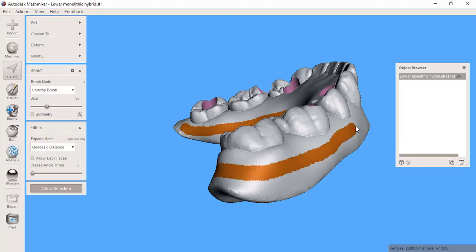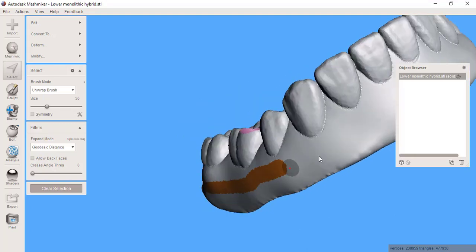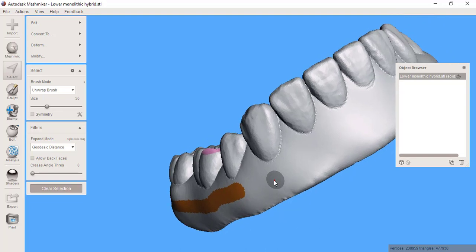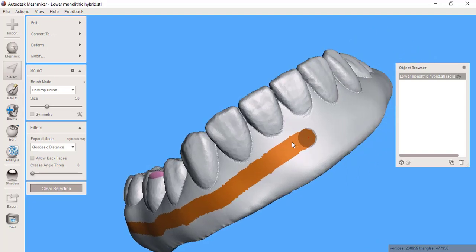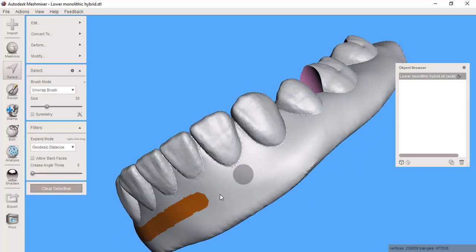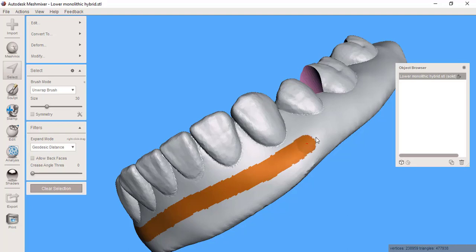I'm going to come right in below the gingival margins of the teeth because you do always end up trimming these a little bit. If I get too close to the borders where you're going to reduce flanges, that might make for having exposed fiberglass which we would like to avoid.